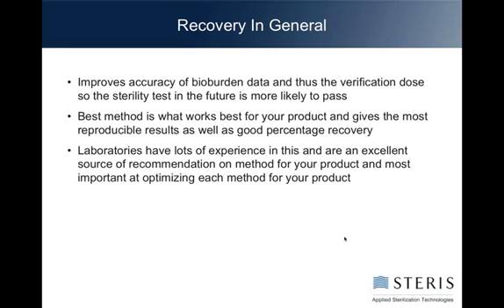Recovery in general, its purpose is to improve the accuracy of bioburden data, and as a result, assure that your verification dose, that sublethal dose used for sterility testing in the future, is more likely to pass. If you underestimated your bioburden, you will be underestimating your verification dose and making it a harder test to pass your sterility. The best method is what works best for your product and gives the most reproducible results, as well as a good percentage recovery.